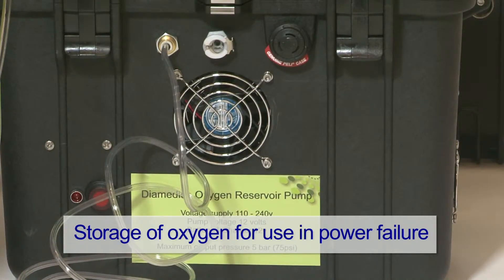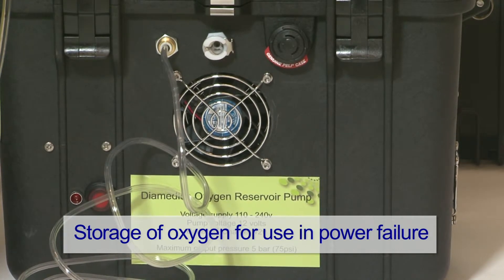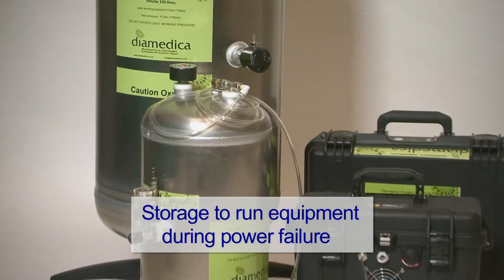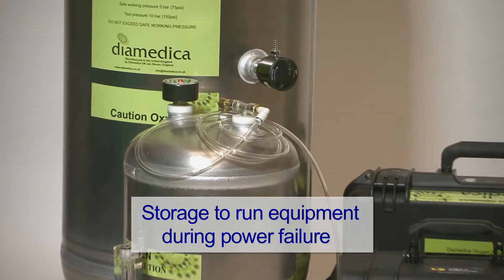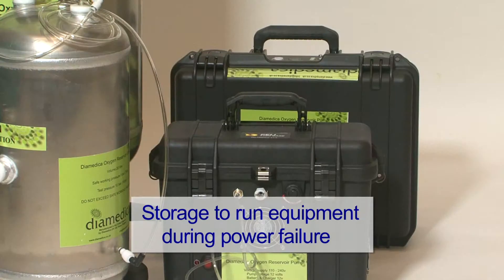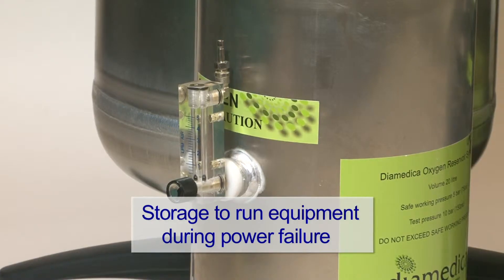This can be used in the event of power failure for direct supply to patients. It can also be used to provide up to 2 hours or 8 hours of additional backup supply to run the Glostervent Anesthesia Machine in the event of electrical failure and no available cylinder oxygen.